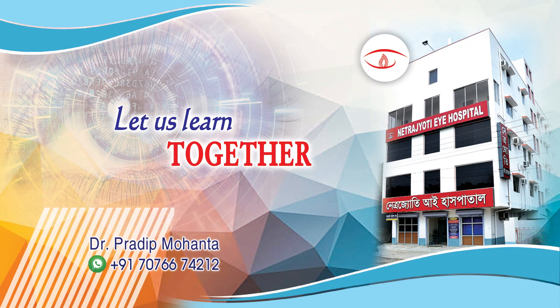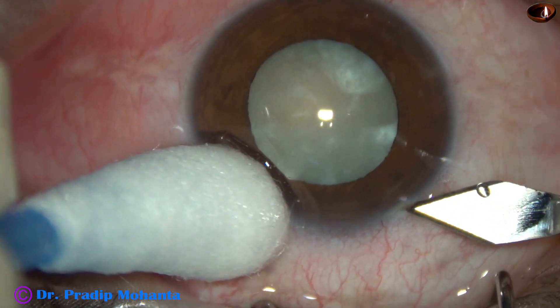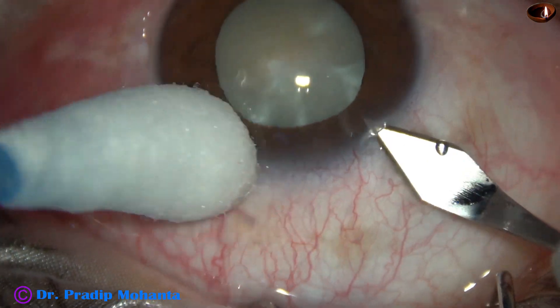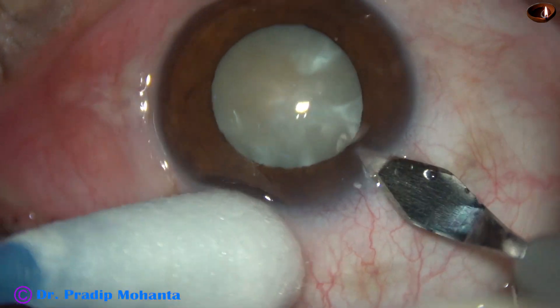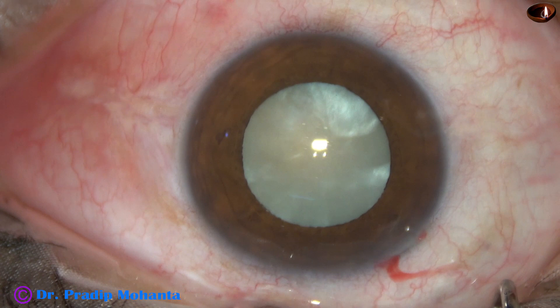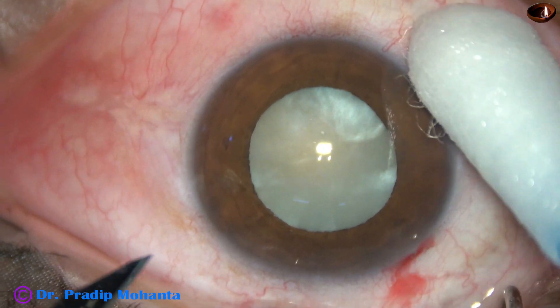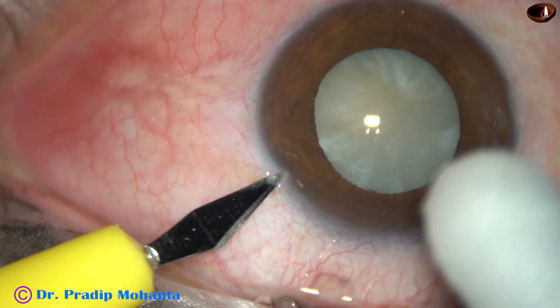Friends, welcome to my workplace at Ranaghat, West Bengal, India. In this surgery, rhexis was difficult. Posterior capsular rent occurred. The pupil became small later in the surgery. Let us see how all these challenges were tackled in this case.